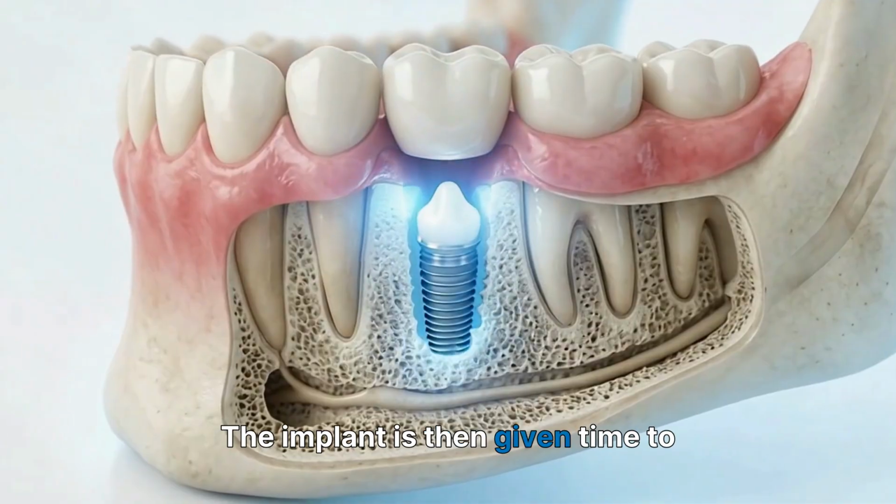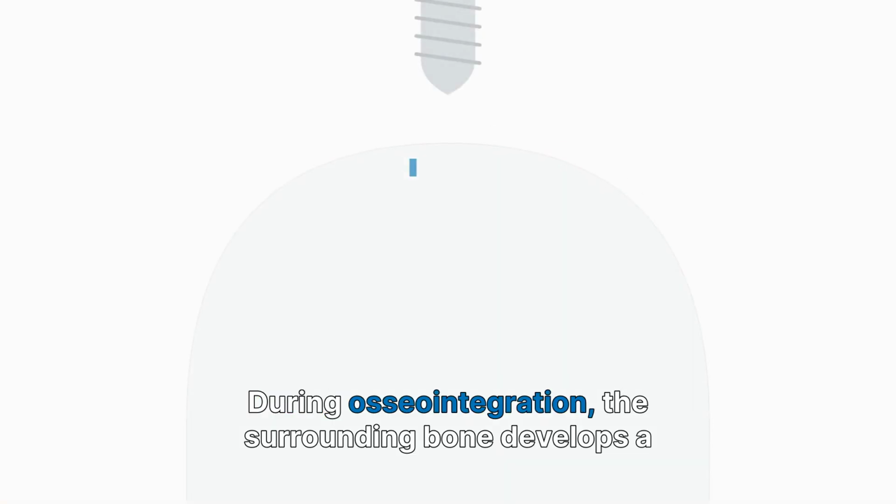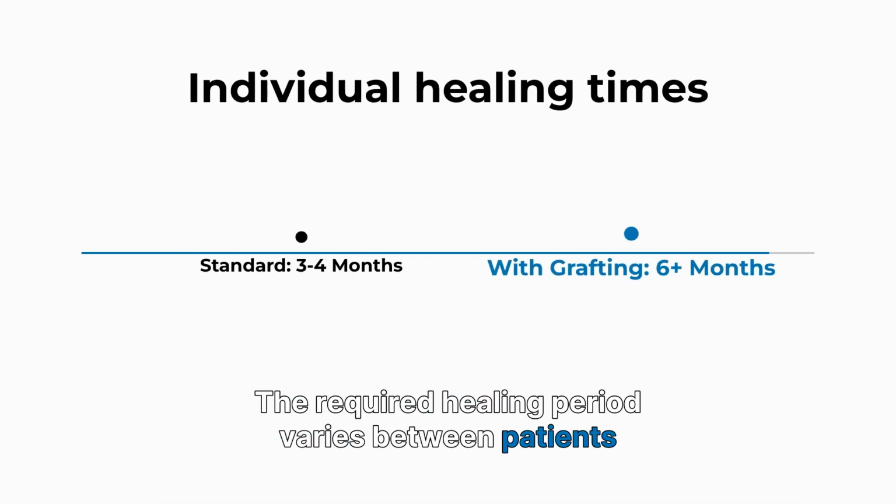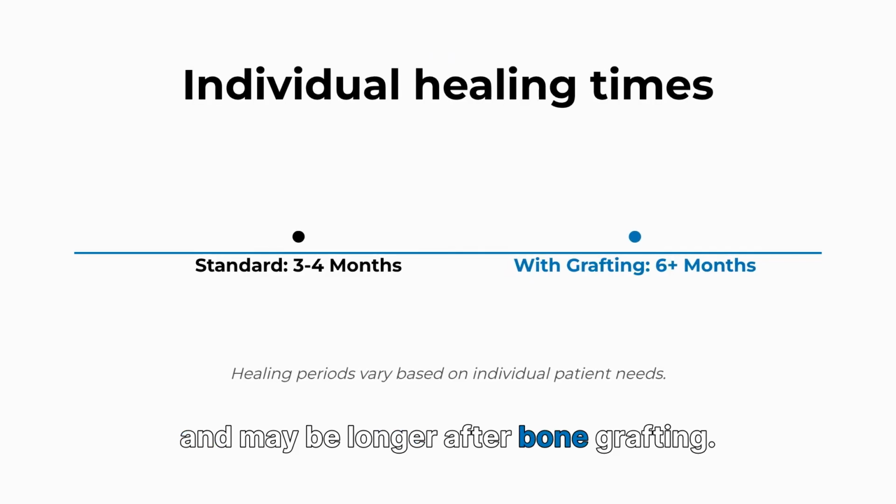The implant is then given time to heal. During osseointegration, the surrounding bone develops a stable connection with the implant. The required healing period varies between patients and may be longer after bone grafting.